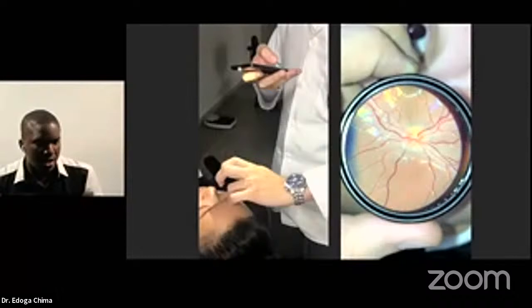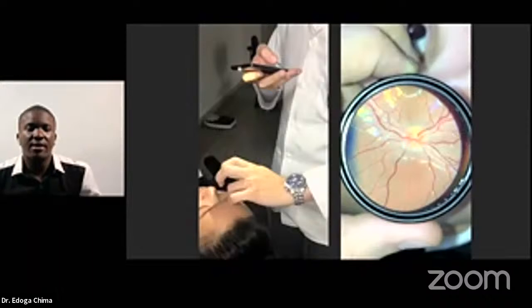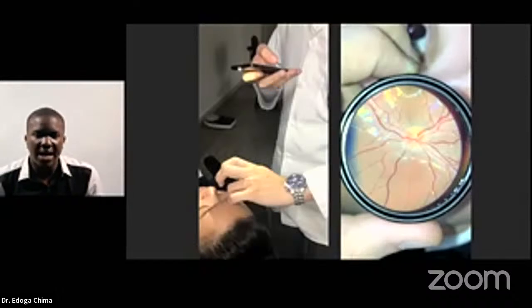Okay, so the fifth factor is actually the ambience, the environment of the examining. It's better done in a room that is dark, just like when you are doing a BIO.